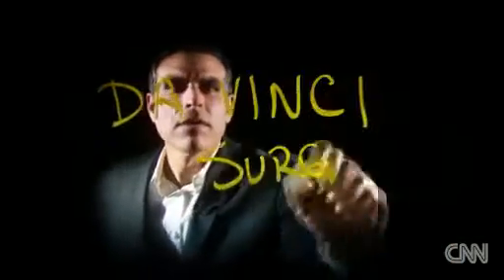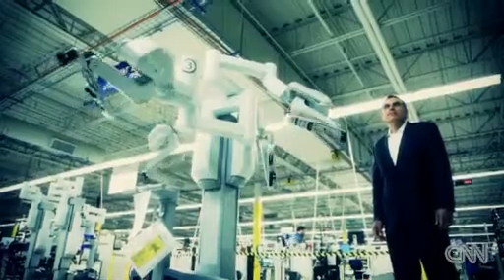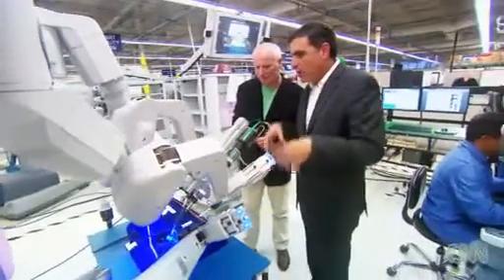What is the Da Vinci system? The Da Vinci is a tele-operated robot, and it is an advanced tool to perform better surgery, to produce better outcomes for patients. David Rosa has been with Intuitive Surgical since the beginning. He has seen the Da Vinci system develop from a concept to the complicated machine it is today. He still remembers the first time he saw it in action.